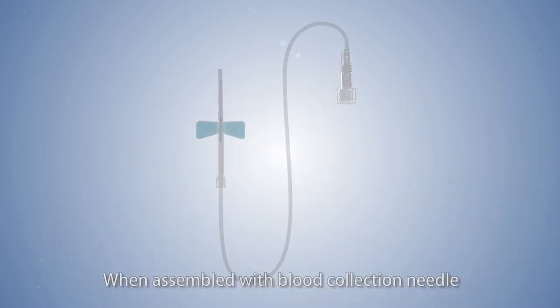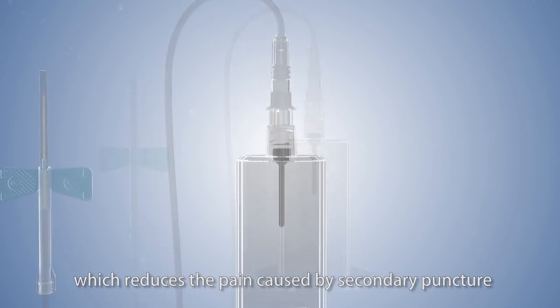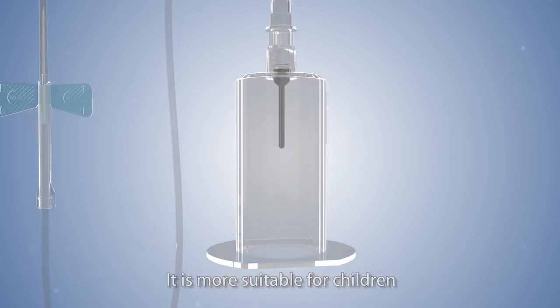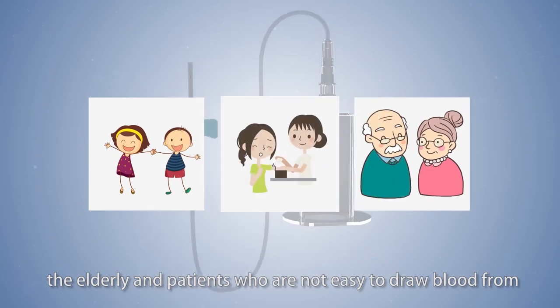6. When assembled with blood collection needle, the Safety Scalp Vein Set can be used as a safety blood collection needle, which reduces the pain caused by secondary puncture. It is more suitable for children, the elderly, and patients who are not easy to draw blood from.